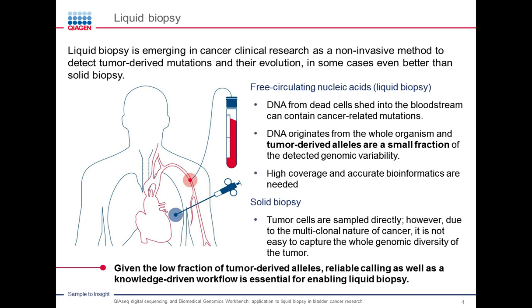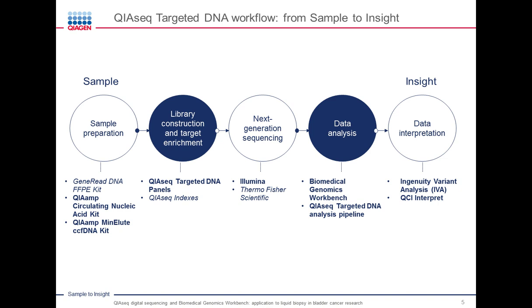So this means that in order to apply what we know to this great potential of the liquid biopsy, we really need to use a smart approach by combining what molecular biology offers us in the laboratory with a bioinformatics that is designed to leverage this kind of molecular biology innovation. And I will try to show you how in these next few slides.